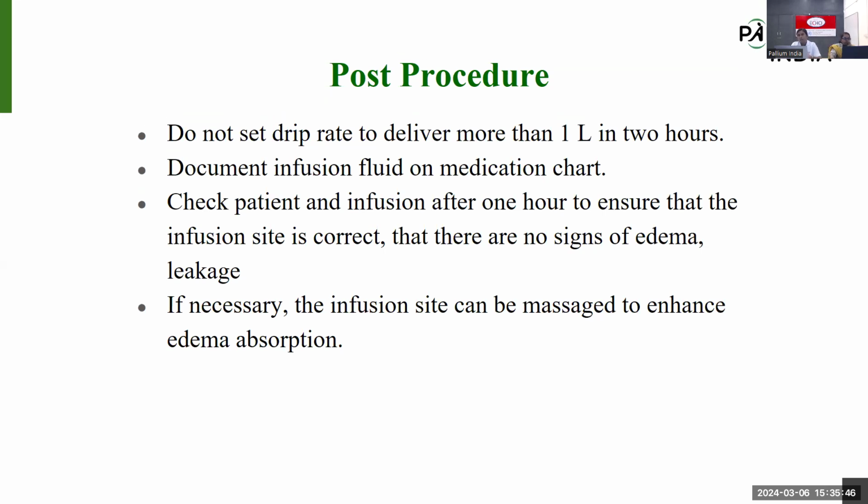Before applying the subcutaneous infusion, we should explain the potential complications that we are expecting. The first one is edema and the second one is leakage. If edema occurs, we should encourage them to do gentle massage on the infusion site. Then what are the advantages? Any idea what are the advantages of subcutaneous infusion?